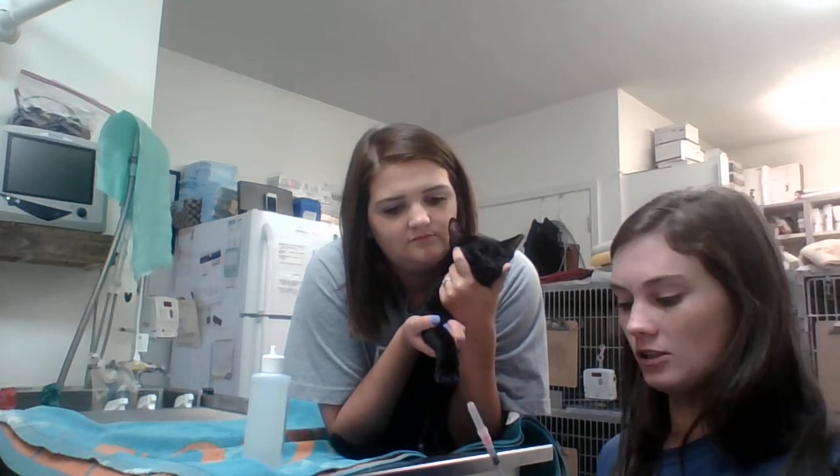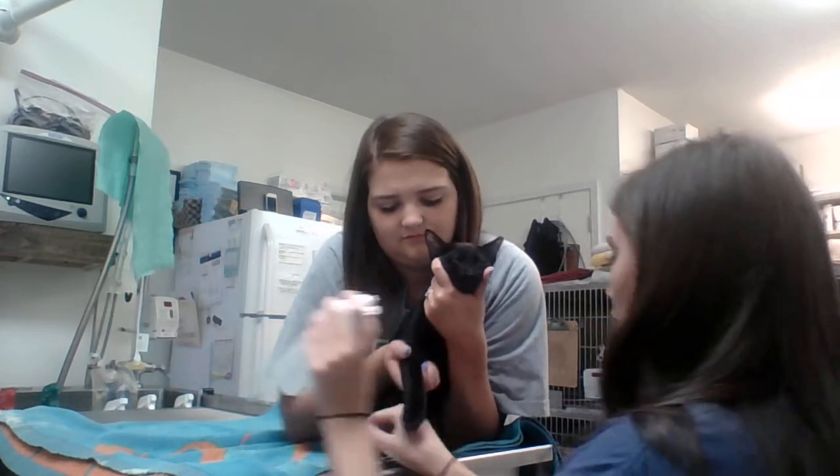Hey, it's Cole and today I will be performing a cephalic venipuncture on Polly. He's one of our clinic cats. First I'm going to break the seal on my syringe so it's easier to pull back on, and I'm going to use some alcohol.